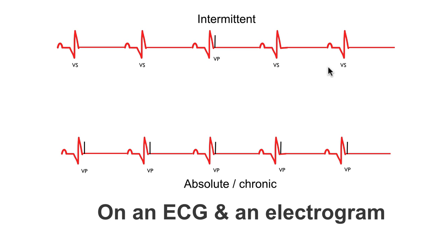Normal service is resumed on the next two heartbeats, so we can say that this is intermittent under-sensing. In the example below, we can see that the atria depolarizes, the AV delay is started in the pacemaker, and again the ventricular depolarization isn't sensed. So just like the previous example, the pacemaker sends an output pulse, which fails to capture the now refractory ventricular tissue.